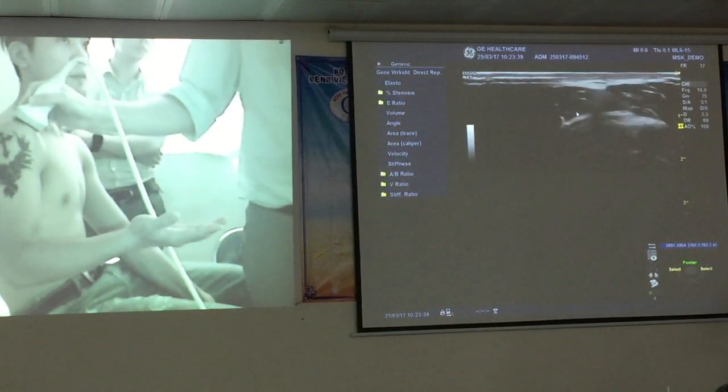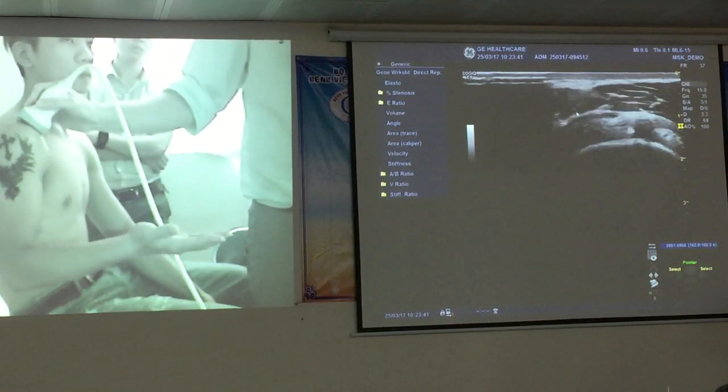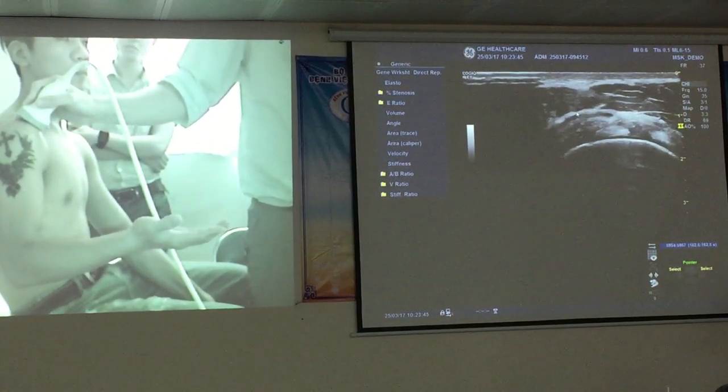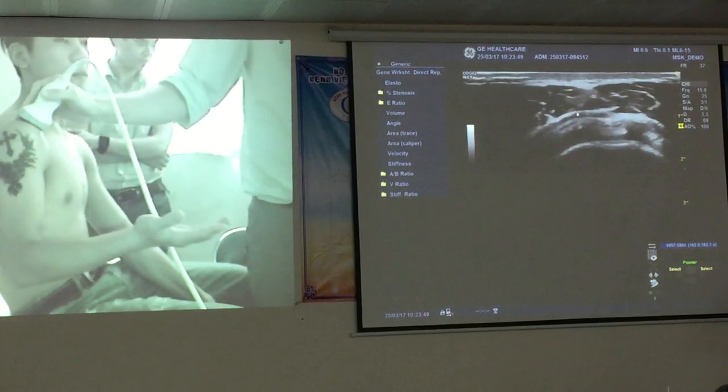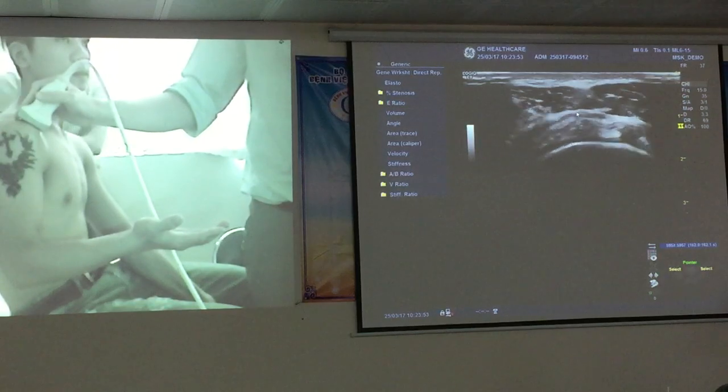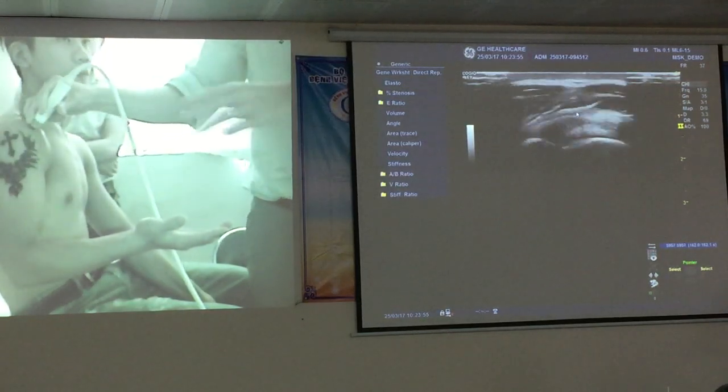Unfortunately, ultrasound is very good at finding things that don't really matter. So we have to constantly go back to, is this relevant to the patient's condition? Cái siêu âm thì rất quan trọng với những cái trường hợp, với những triệu chứng của bệnh nhân xem là không quan trọng nhưng mà siêu âm sẽ phát hiện ra được.